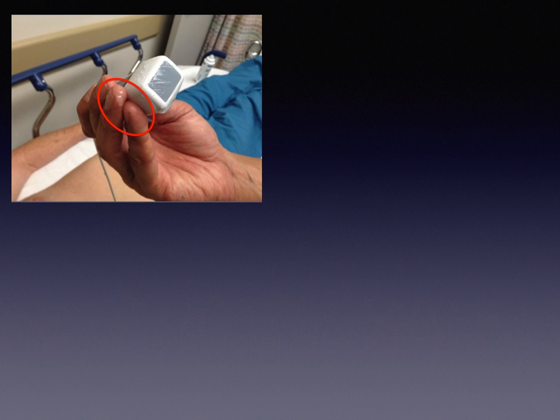I want to start very easy with simple orientation issues, and we're going to use one dollop of gel placed on the patient, and then we'll paint from it. Put away the gel, or we'll lose it. Hold the probe with one grip as shown, so we don't lose orientation, and perform the same full exam every time, so that we get good at all its components.